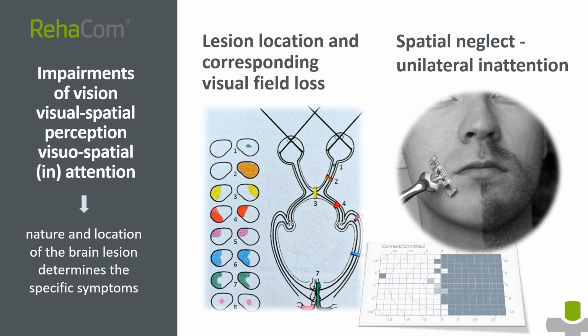A visual field test is a method of measuring an individual's entire scope of vision. The visual field testing is used to detect signs of conditions affecting the optic nerve and the occipital cortex, where this information is processed into vision. Tests are also used to identify a visual spatial neglect in patients with unilateral brain injury.